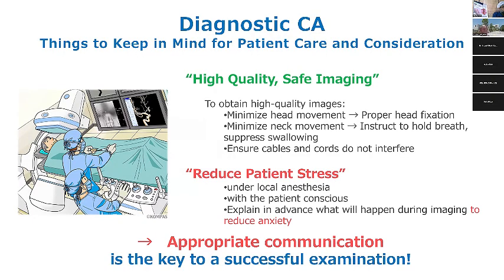So in summary, catheter angiography remains a cornerstone of neurovascular diagnosis and planning. Understanding both normal and pathological features enables better treatment decisions. Okay, I'll finish my presentation.